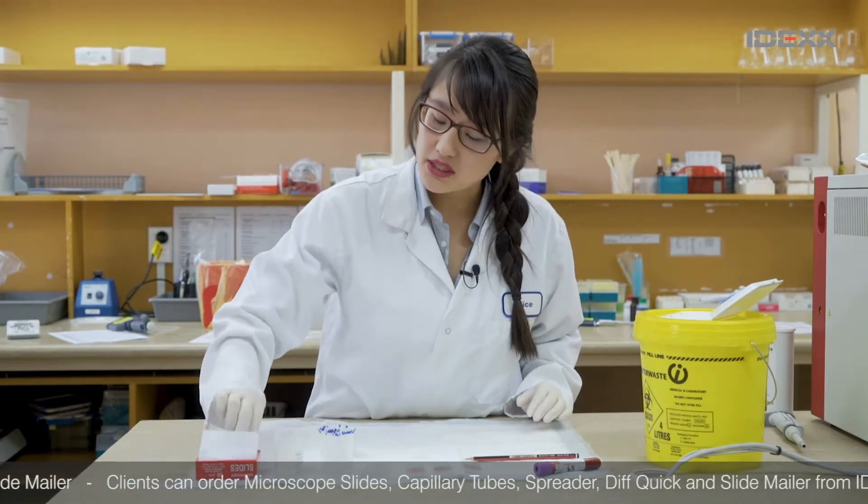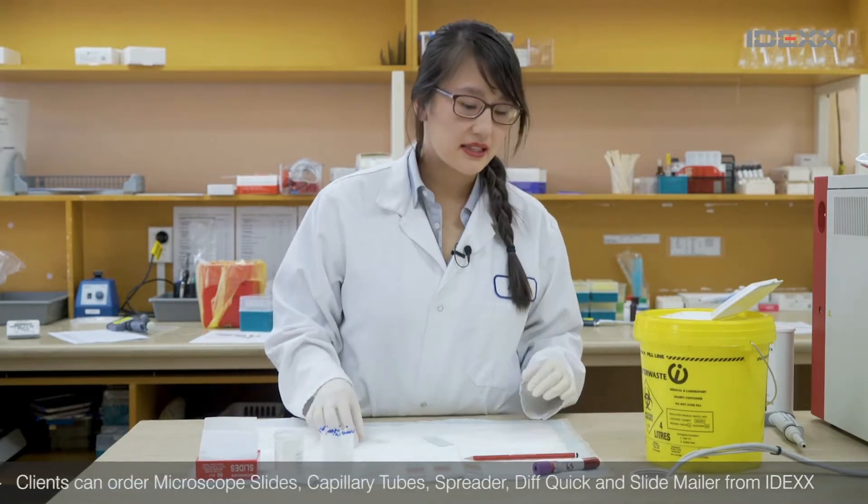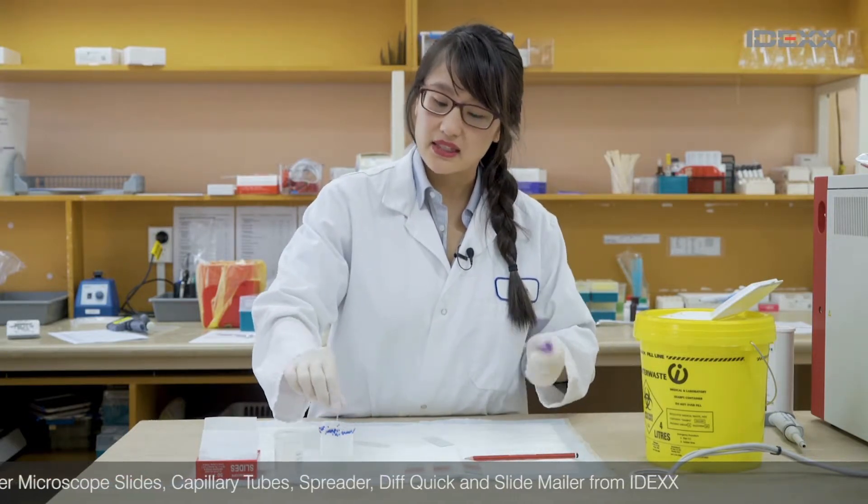We do suggest making two slides, so that you have one fresh slide to send, and if you want you can also stain the other and have that sent to us as well.